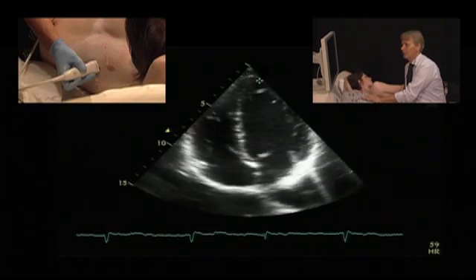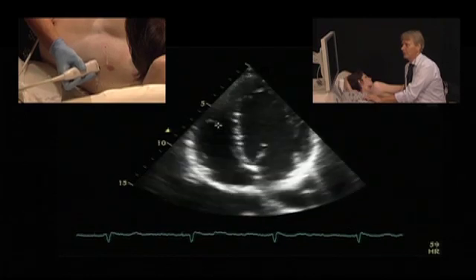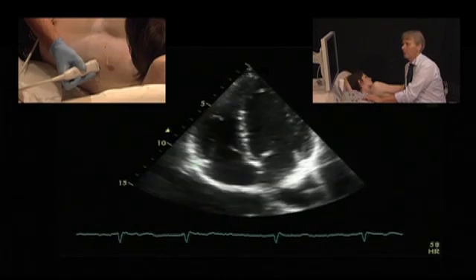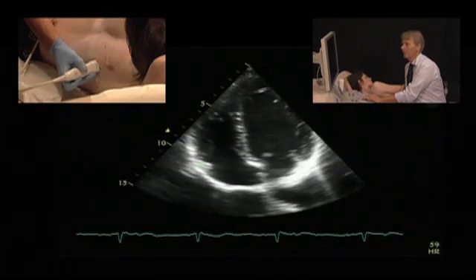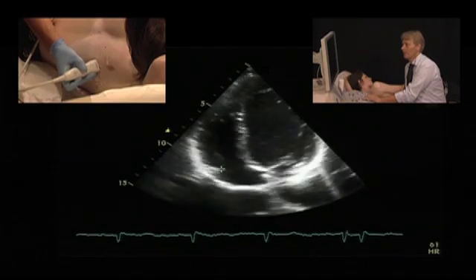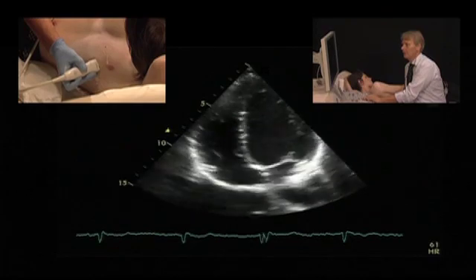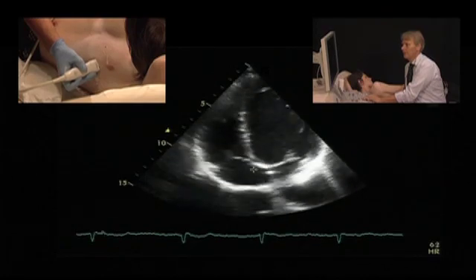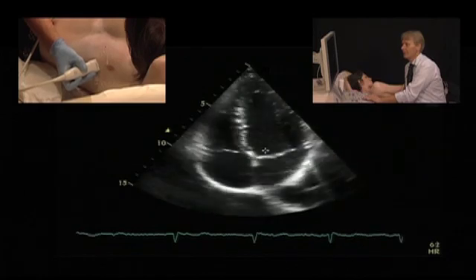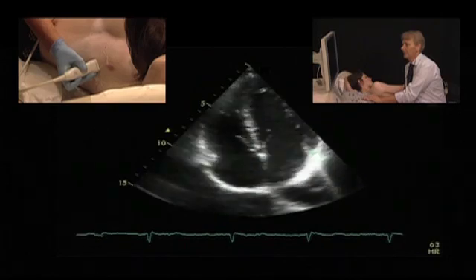We have the lateral wall of the left ventricle, the septum, the right ventricle with a moderator band, and the lateral wall of the right ventricle. Then we have the left atrium, the right atrium, and the interatrial septum with the fossa ovalis. We have the tricuspid valve with the septal leaflet, and the mitral valve with the anterior leaflet and the posterior leaflet.